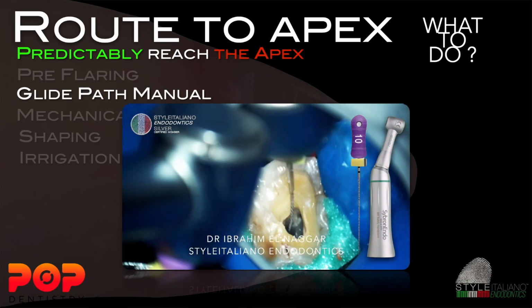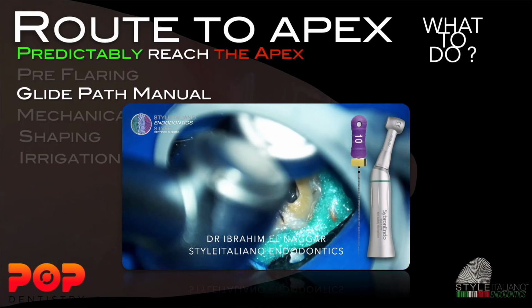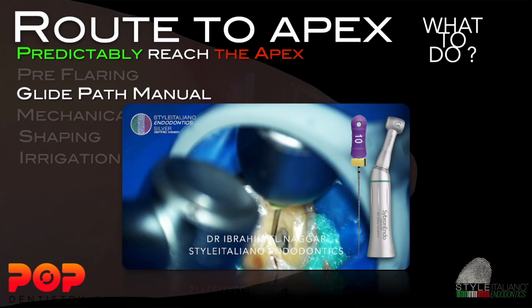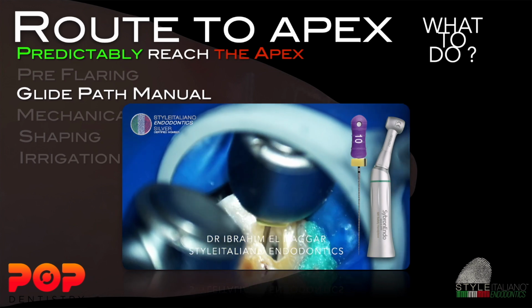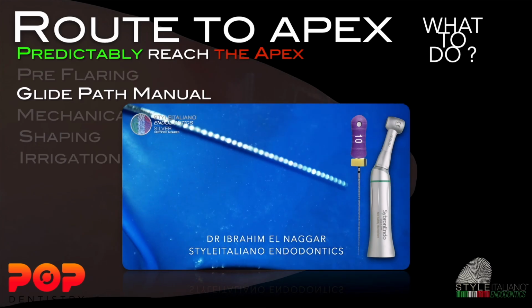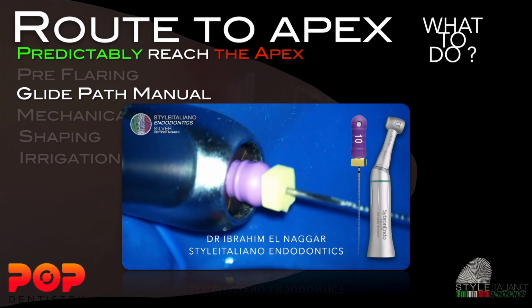I cannot do this action with my files in a predictable way in every case. In this case, you can see I was having trouble entering the canal, so I attached my handpiece to my manual file and let it do the job. You can see how smooth the file is progressing, extremely safe, 30 forward and 30 back, and I also can adjust the speed.